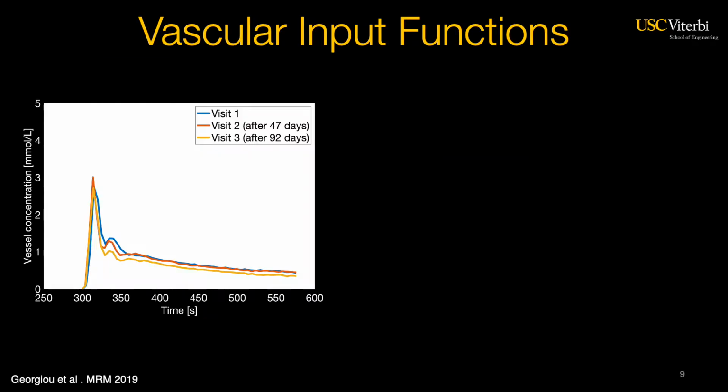We next assess the repeatability of VIF estimation. Here shows a representative case of 3 vascular input functions for the first visit and the 2 follow-up exams. The vascular input functions are in overall good agreement.